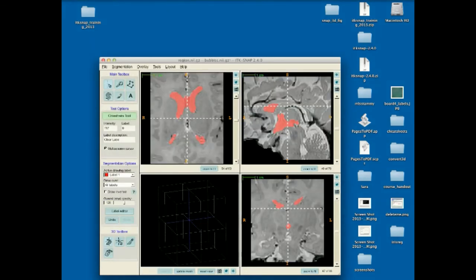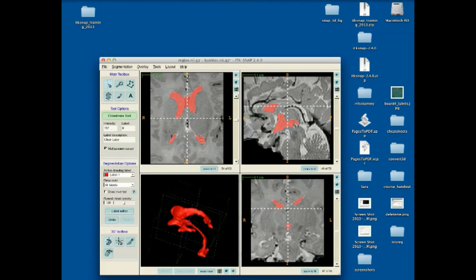If you want, you can save it as another file, as a segmentation file, and keep the results there. You can also visualize in the 3D view panel. So yeah, that's basically exercise 7A. Why don't you try this out, and let me know if you have any problem. And we will have a follow-up exercise next to try to edit this segmentation.